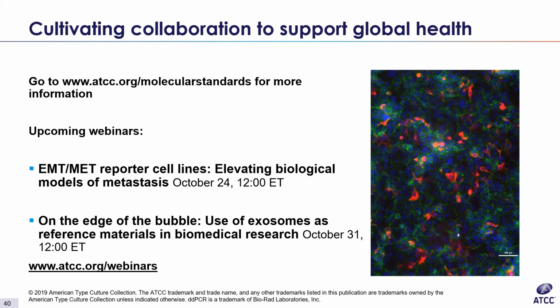Okay, but we do use the seed stock principle, right? Which generally means that the organism that's distributed is going to be as close to the original organism as possible. Right. So we have some assurances, but no guarantees. Okay. All right. That's reasonable.